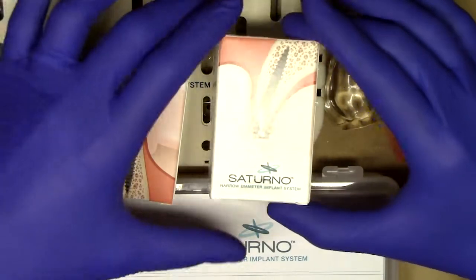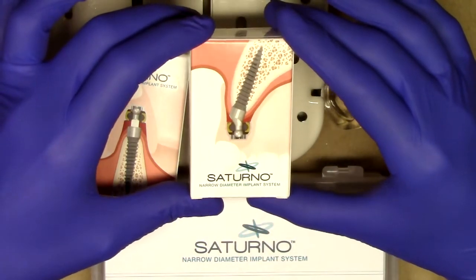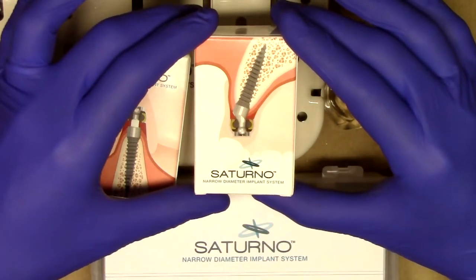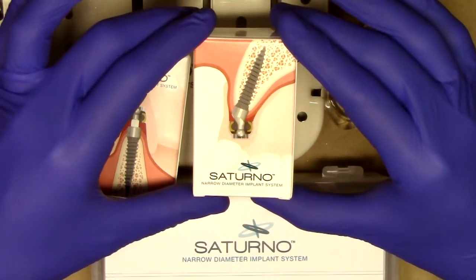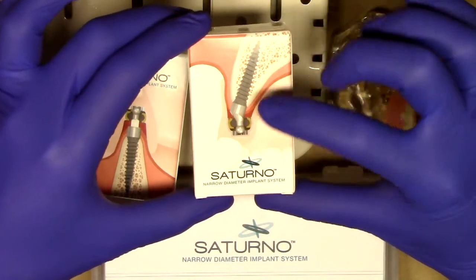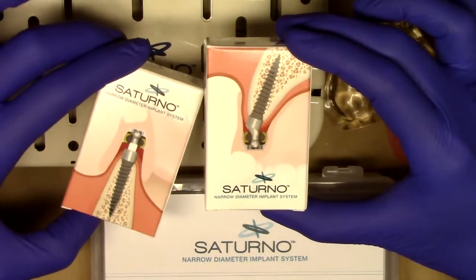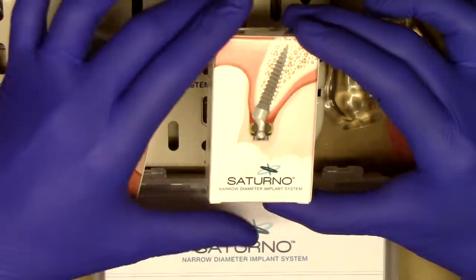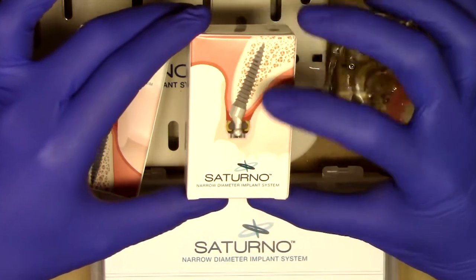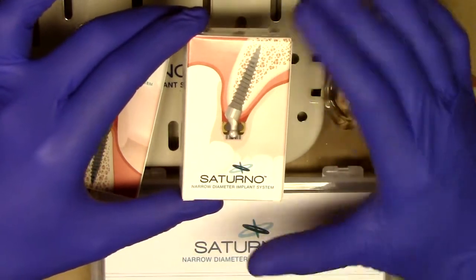Introduced new to the market, specially designed by Zest Anchors for really tricky maxillary situations and other angled bone situations, is the Saturno 20-degree angled narrow diameter implant. This exciting design is also a one-piece dental implant similar to the straight Obal that you saw earlier, but using a 20-degree angled abutment. That abutment is also connected to the implant in a one-piece design for simplicity.